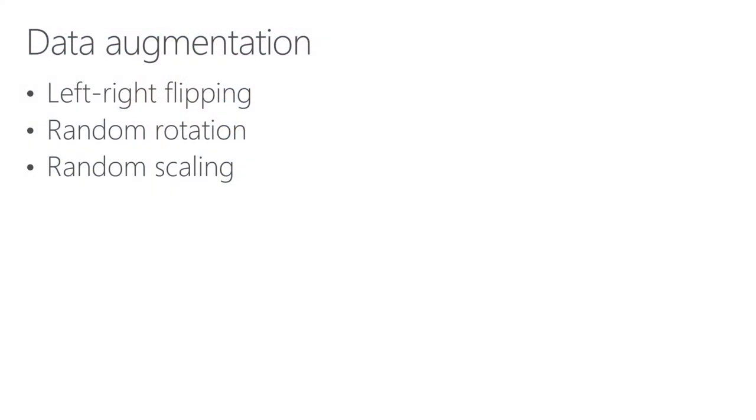Sure. So after we have this model, first, of course, data augmentation, as always, right? If you think of chest X-ray images, usually you want to flip them left and right, but you don't want to flip them up and down because that doesn't make sense. And you also want to zoom in, zoom out a little bit, and also rotate a little bit, because when radiologists or technicians take the chest X-ray pictures, usually they don't put it in a very strict vertical position. So data augmentation is a way of getting more data. Yeah. So you take all the pictures and flip them, zoom in, zoom out, that kind of thing. Okay, that's awesome.